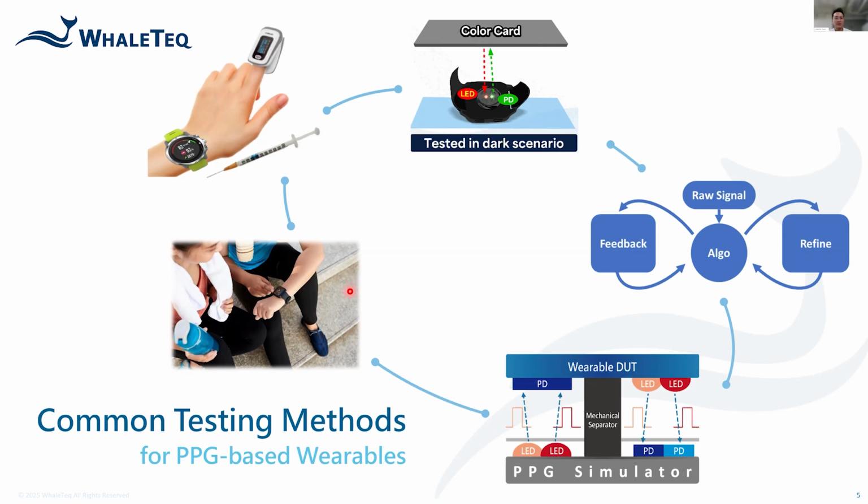So they collect data from real users in various scenarios, and it is cost-friendly compared to others. But sometimes, limited by the health status of personnel, we don't get to easily collect data from or invite the people in need of healthcare to join this kind of try-on. So in short, the optical simulator and database verification are cost-effective and allow rapid testing. And clinical trial is essential for ensuring the device accuracy and reliability.